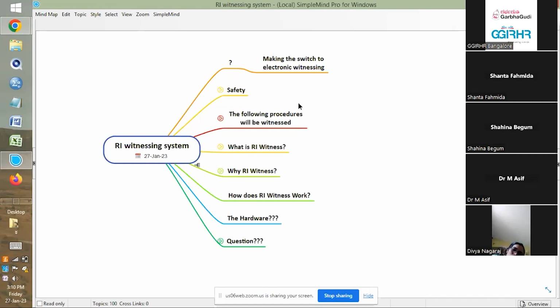Like that, all pre-implantation embryos look the same. You can't tell which embryo belongs to whom. Only the labeling, the proper lab protocol, saves us, or else it is very easy to get mixed up.